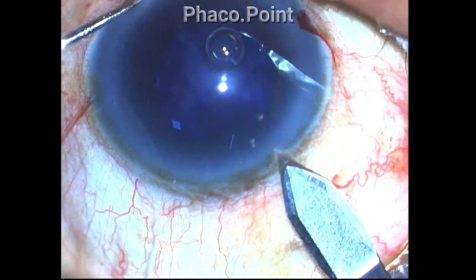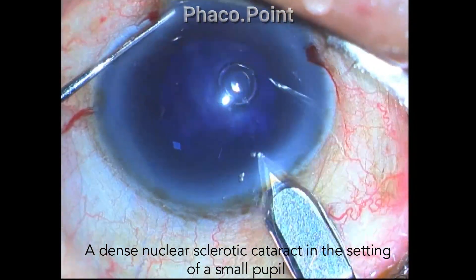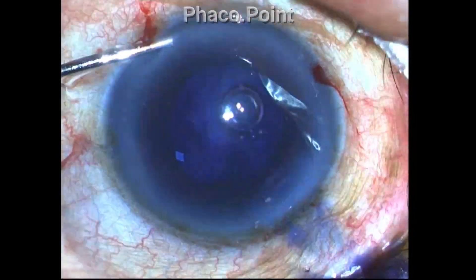This was a small pupil and in addition there was a very hard grade nucleosclerotic cataract. As you know, it's imperative to stain the anterior capsule with Trypan Blue dye.